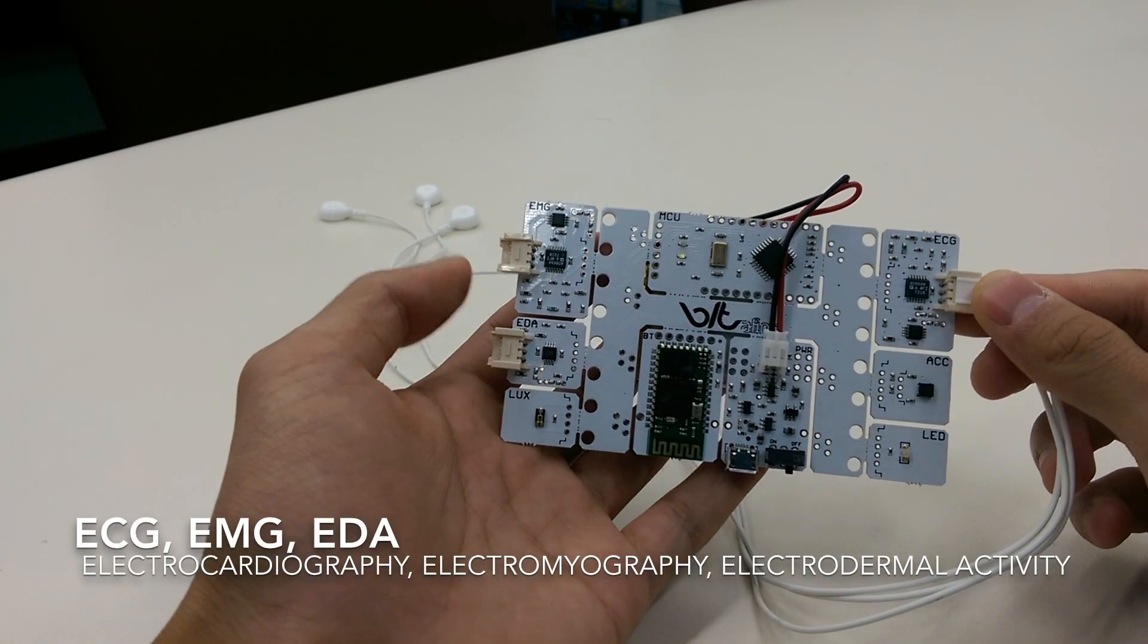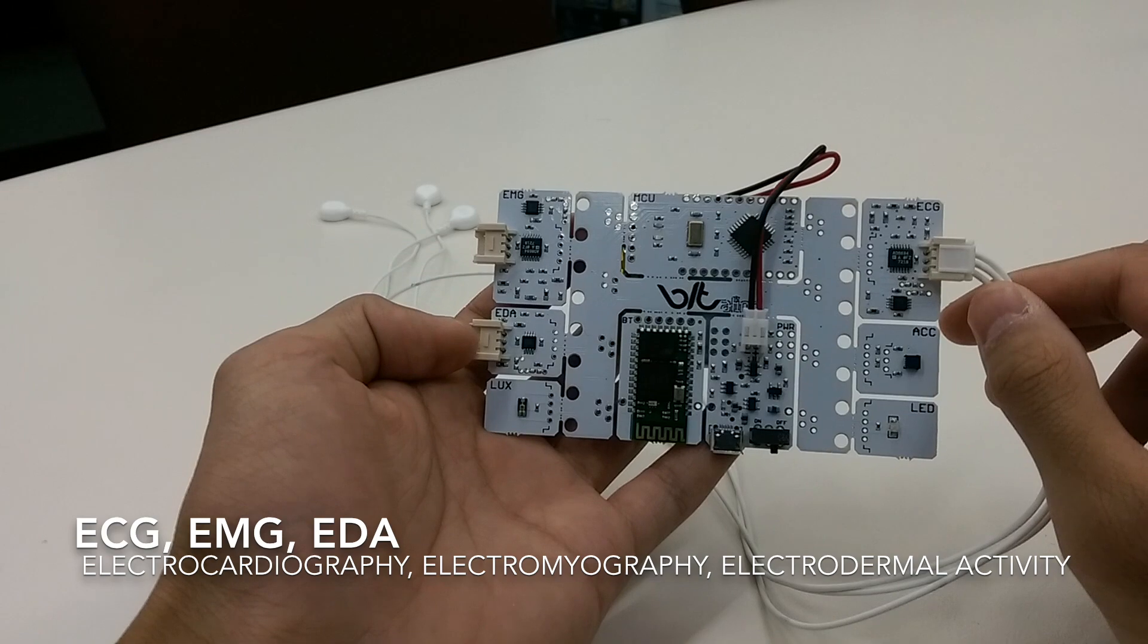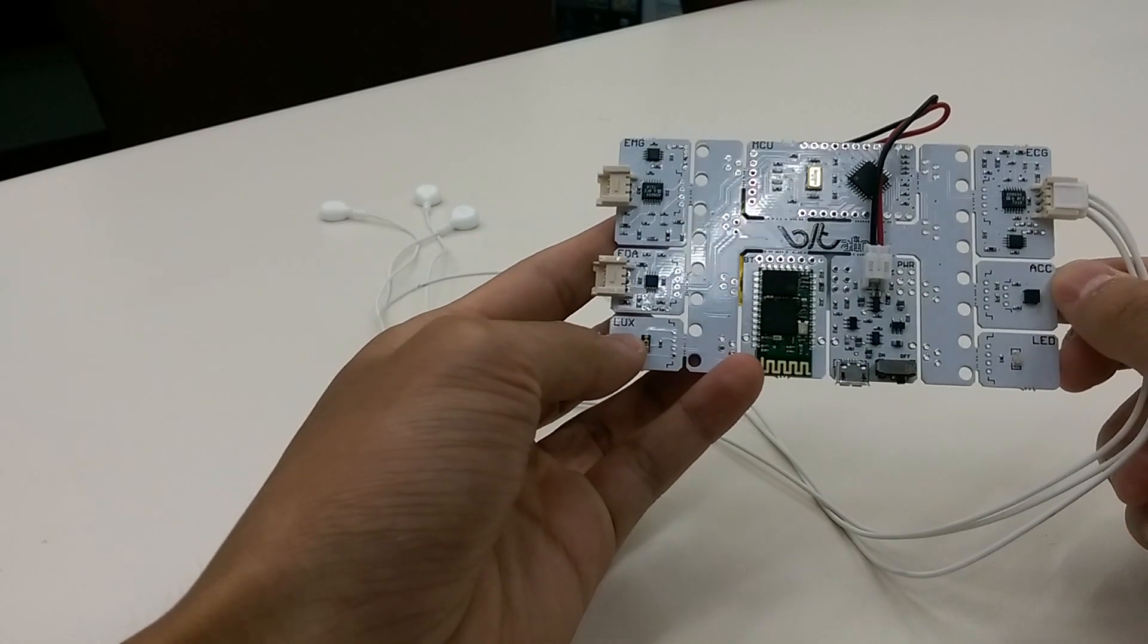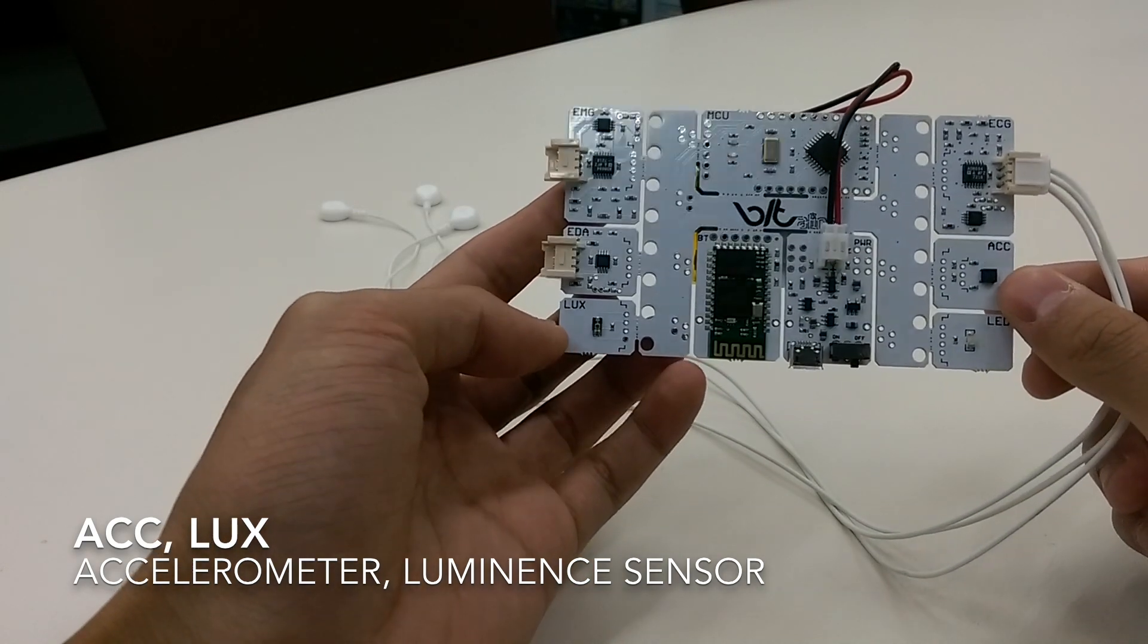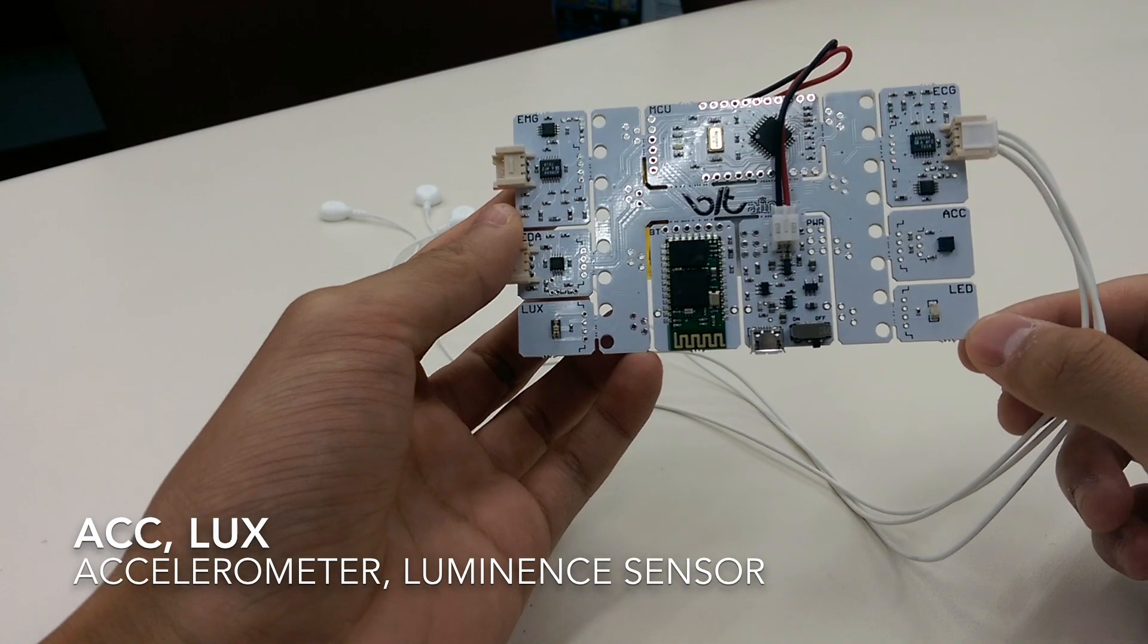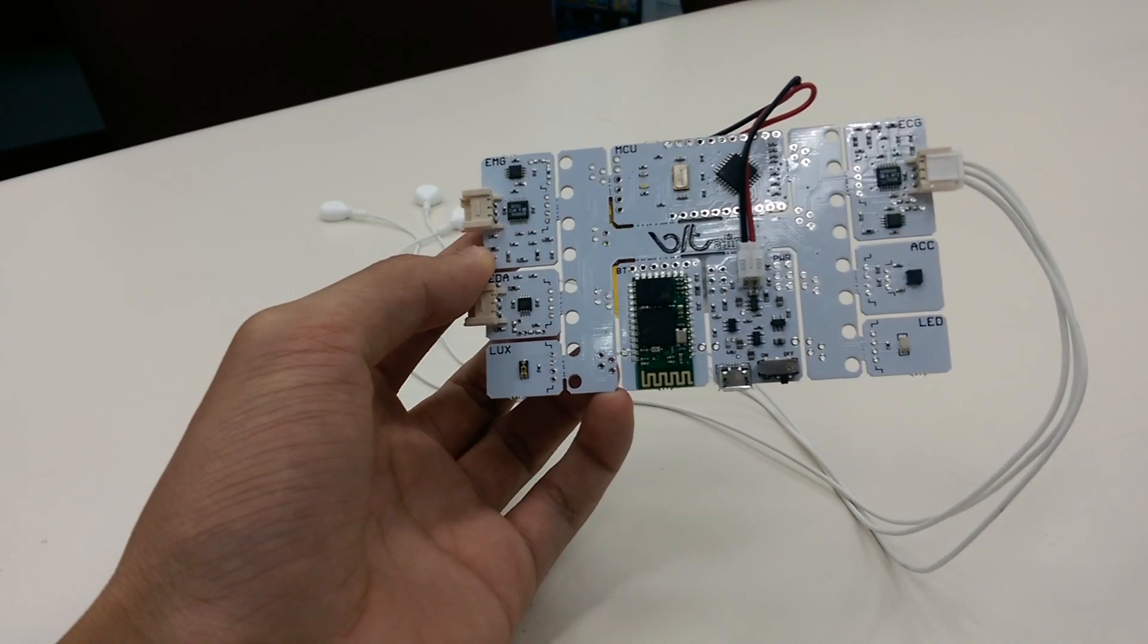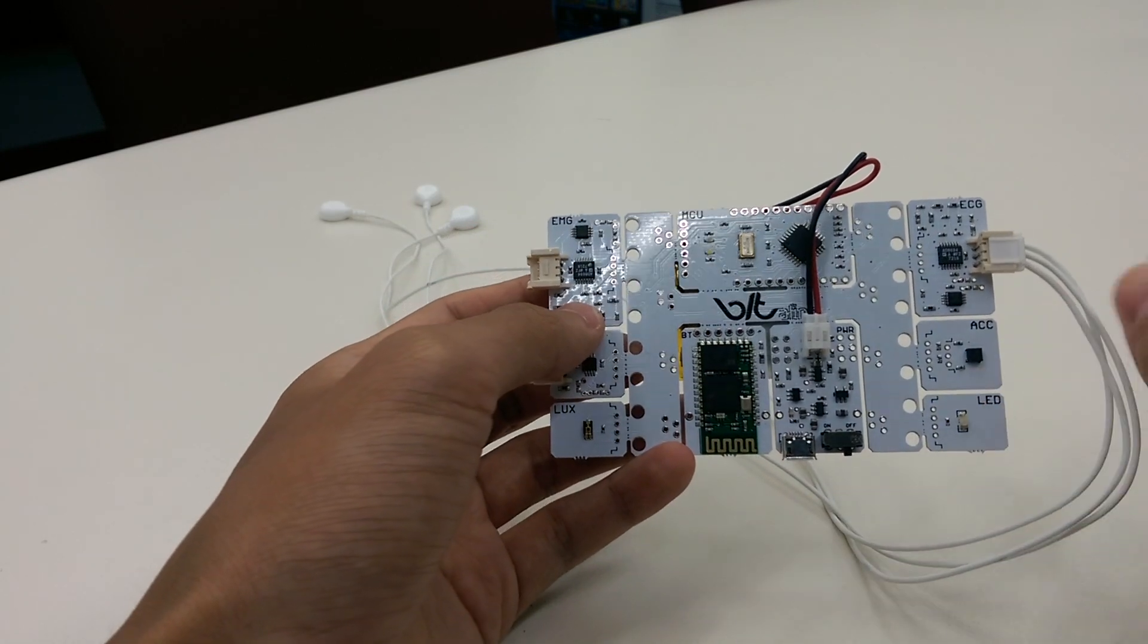The three that it does collect is the ECG, the EMG, and the EDA. The other two are environmental—so the accelerometer and the luminance detector. The final one, the LED, is actually for the user, but I'll get back to all of them very shortly and in more detail.